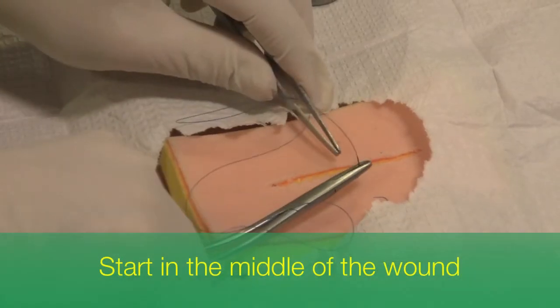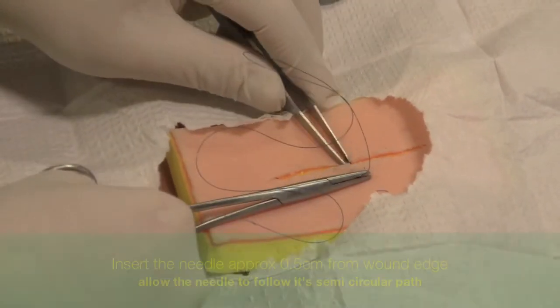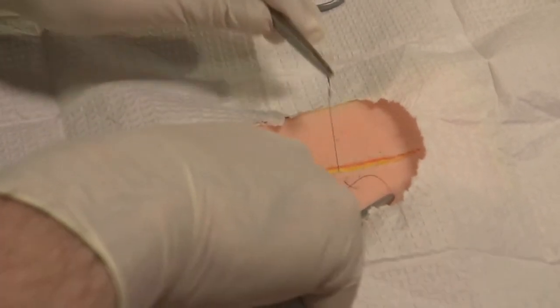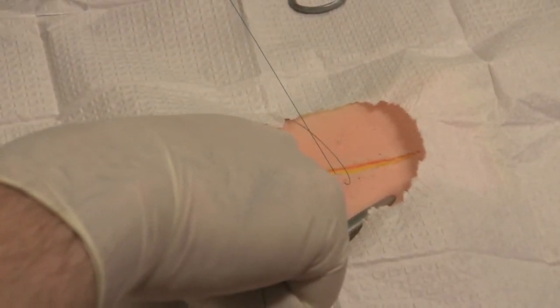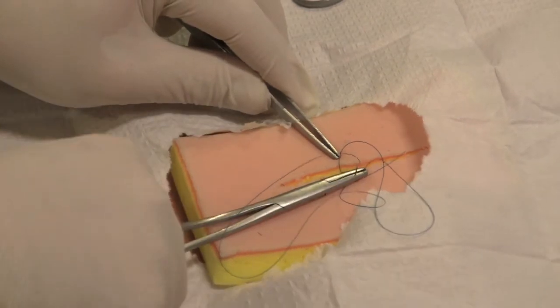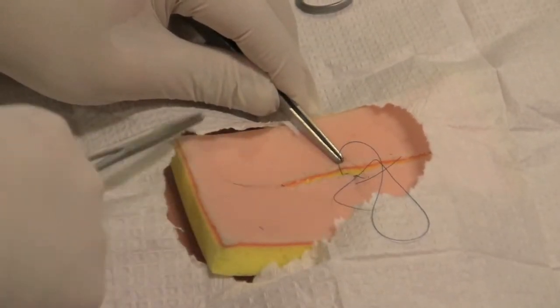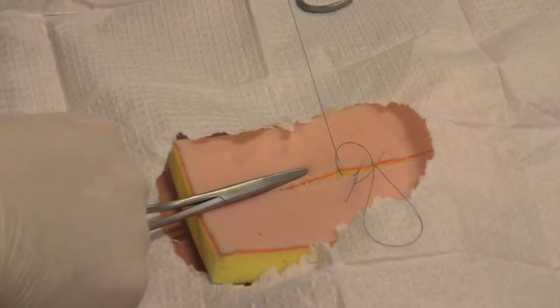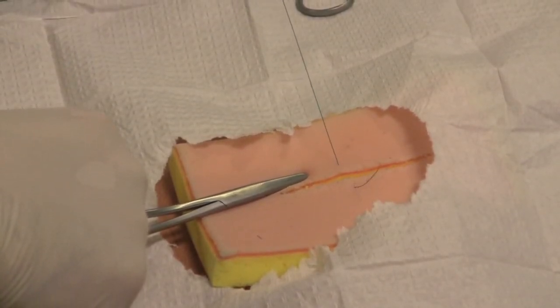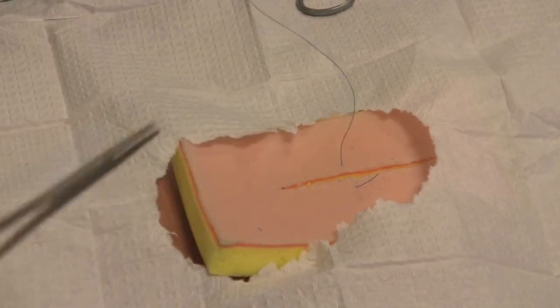Having draped the wound appropriately to avoid contamination, pass the needle through one side of the wound about half a centimetre away from the edge of the wound. Let the needle follow its natural course and natural curved shape through the edge of the wound. Bring it up through the middle and then pass it through the other side of the wound, trying to get the same depth and distance from the wound so you have an even bite on both sides of the wound.